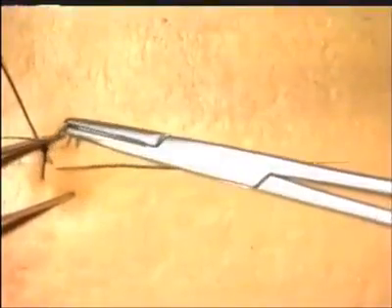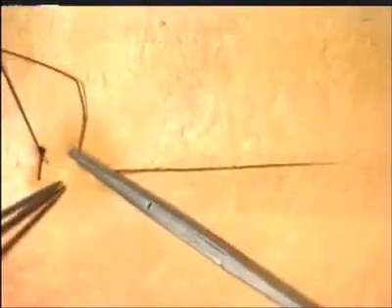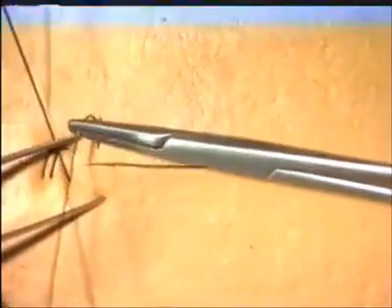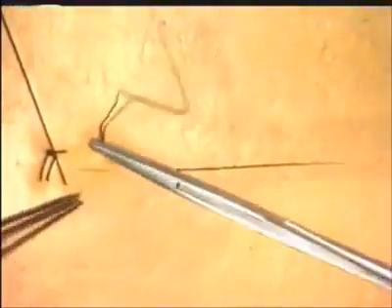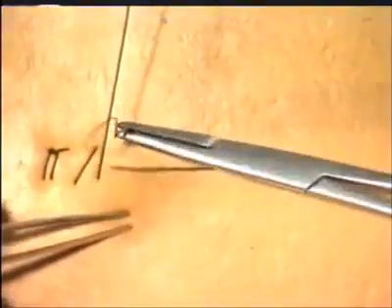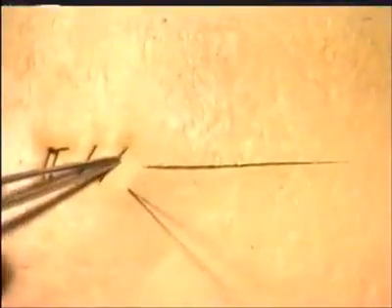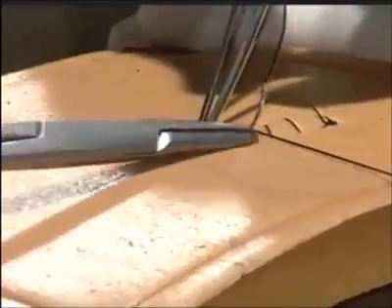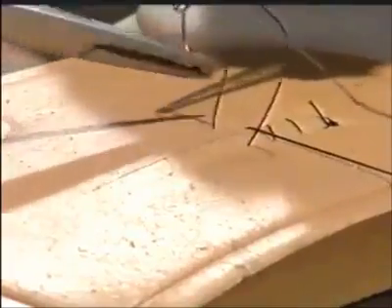The second suture is put in in a standard manner as before, and then the suture snugged down, and handed to your assistant. Here comes the third suture, the distance apart being exactly the same as for interrupted sutures. Work along the wound, each time ensuring the same tension, and then hand it to your assistant, who maintains that tension. Work along the wound, ensuring equal distance between the sutures, to ensure the same tension down the whole length of the incision.